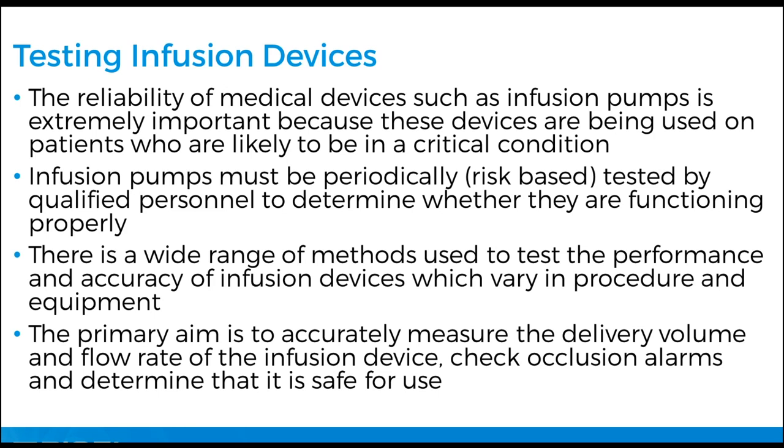There is a wide range of methods to use and test, and I'm going to go over some of these because I think it's important from a metrology point of view. Going over different methods, let's have a look at the pros and cons of these different methods. But the procedures are still valid. There's nine different ways to skin a cat in regards to measuring flow rates and determining if an infusion device is fit for purpose and meets manufacturer specification.